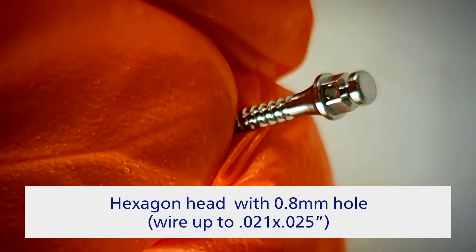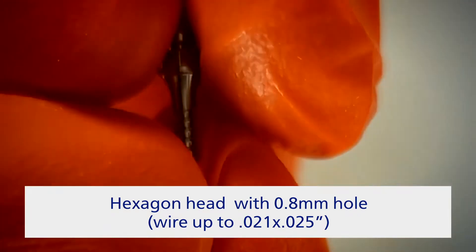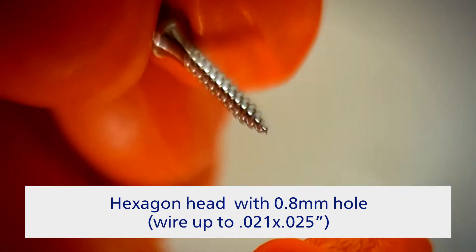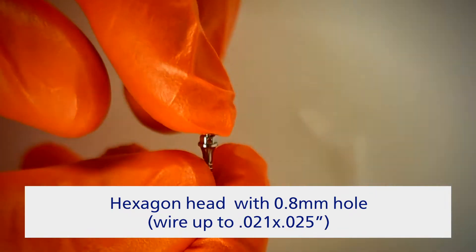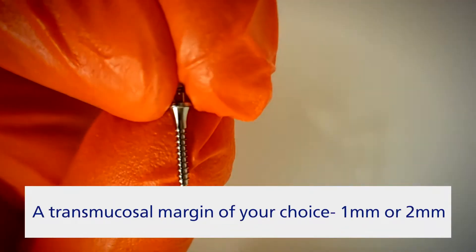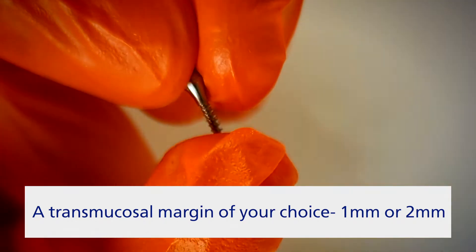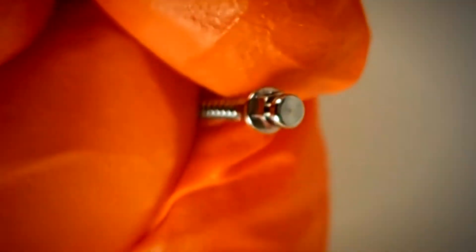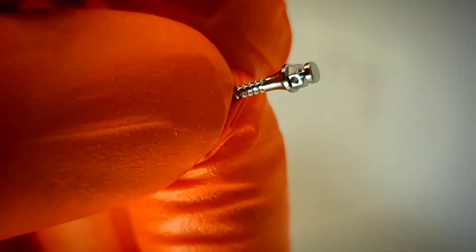The mushroom-shaped head, rounded for patient comfort, features a hole of 0.8 millimeters suitable for wires up to 21x25, with a hex especially for scaling application for orthodontic accessories. A trans-mucosal section provides perfect adaptation to peri-implant soft tissues. A hexagon head ensures improved stability during installation, and the simple design allows easy attachment of coil springs and elastic chains.